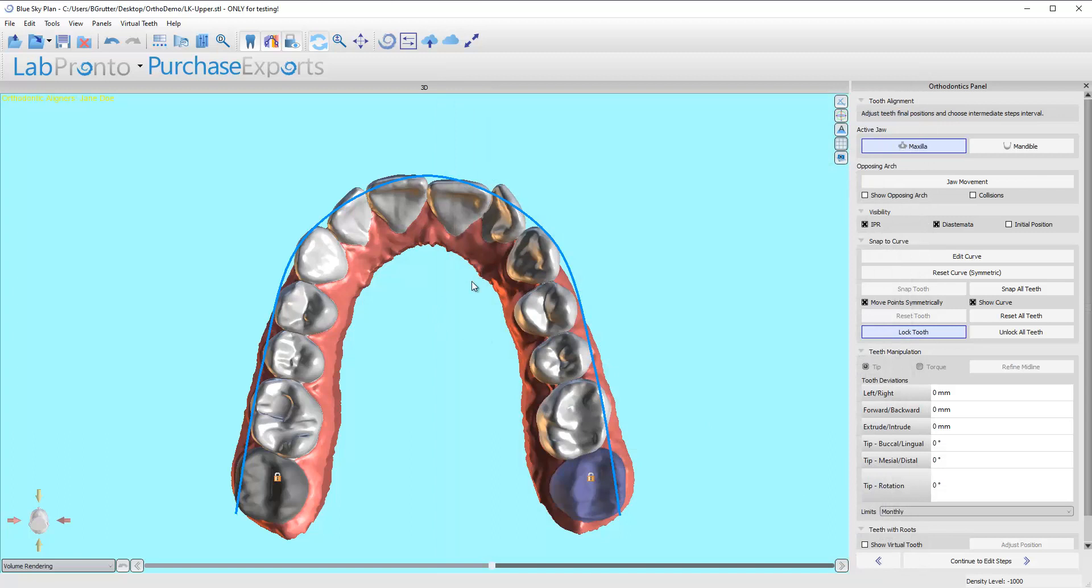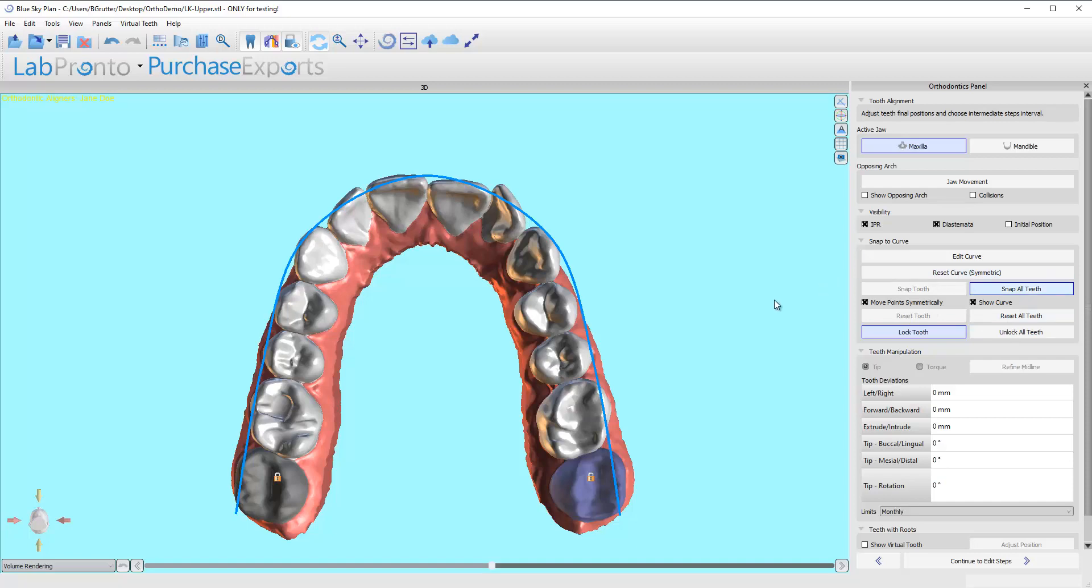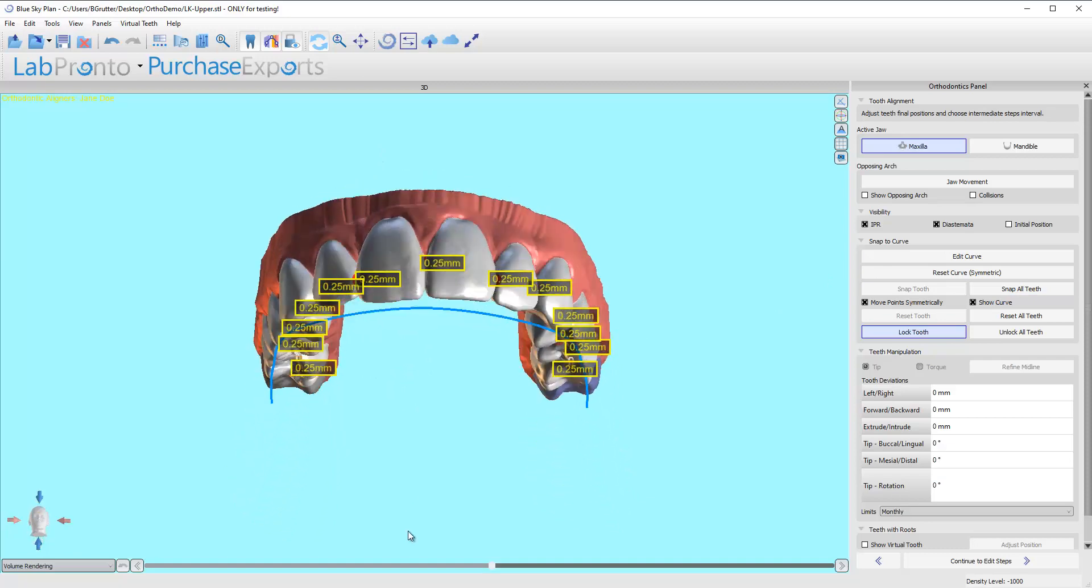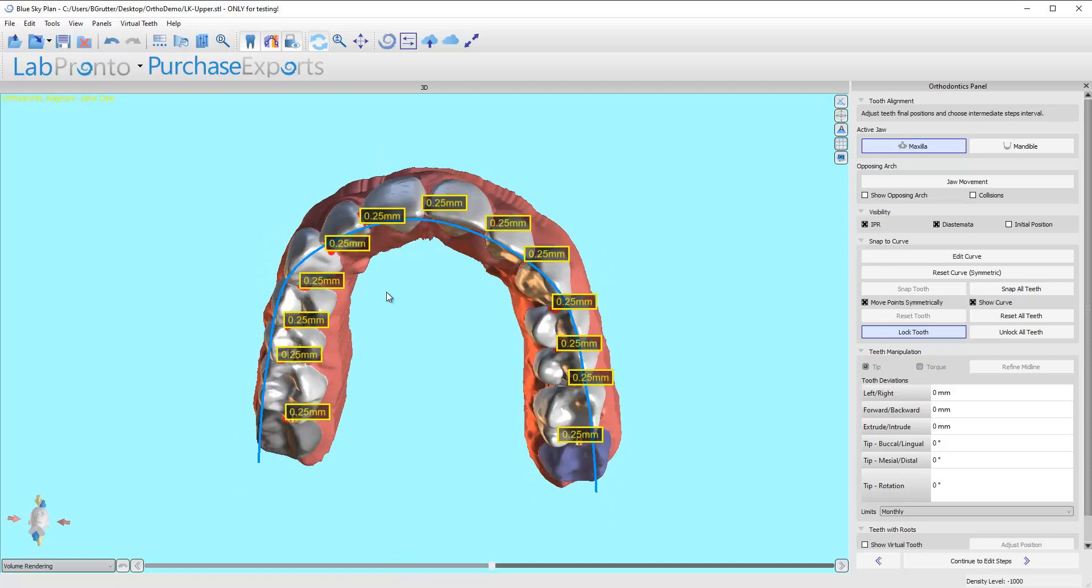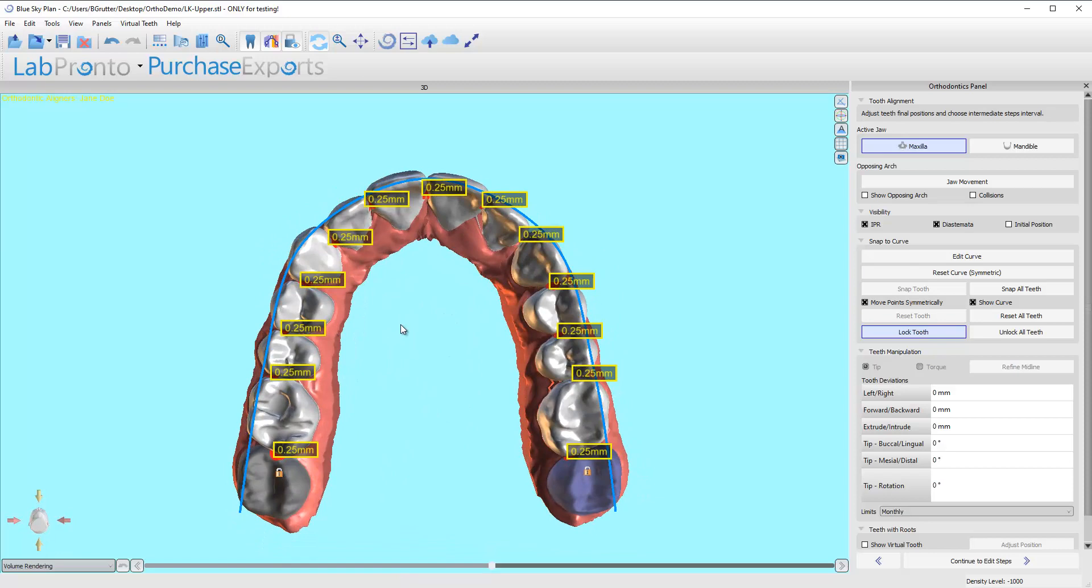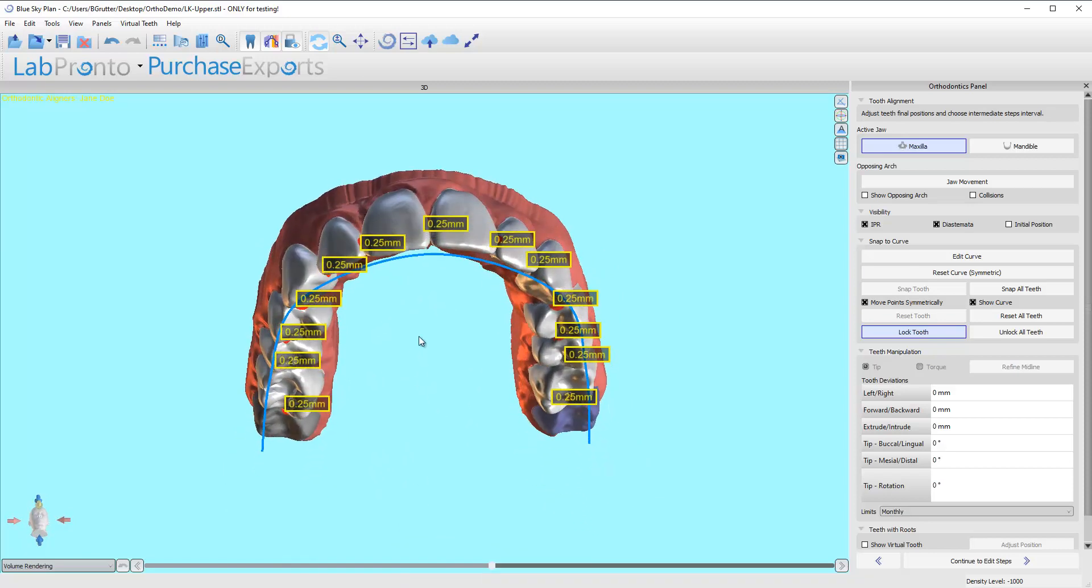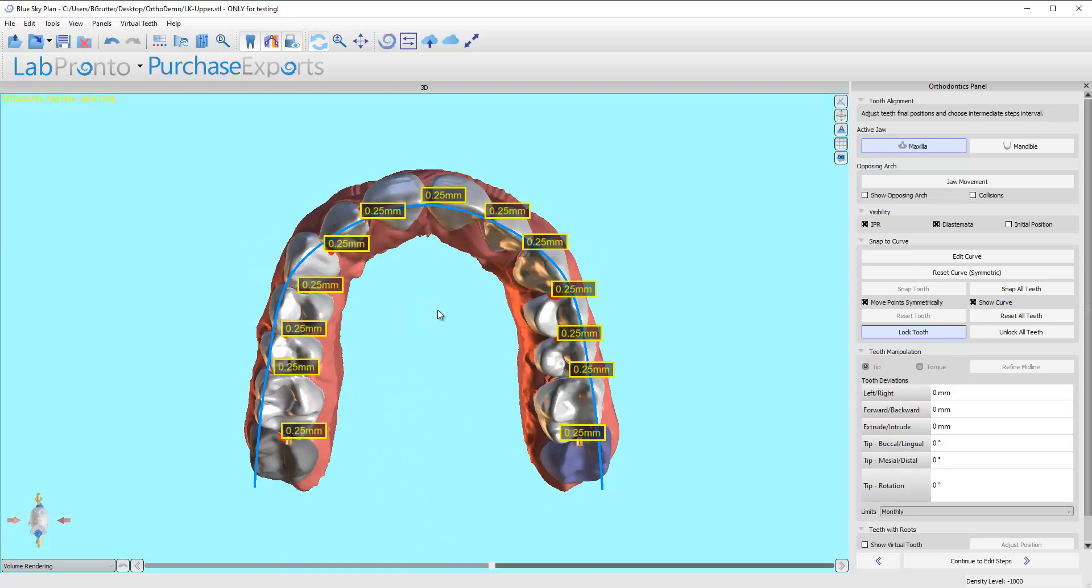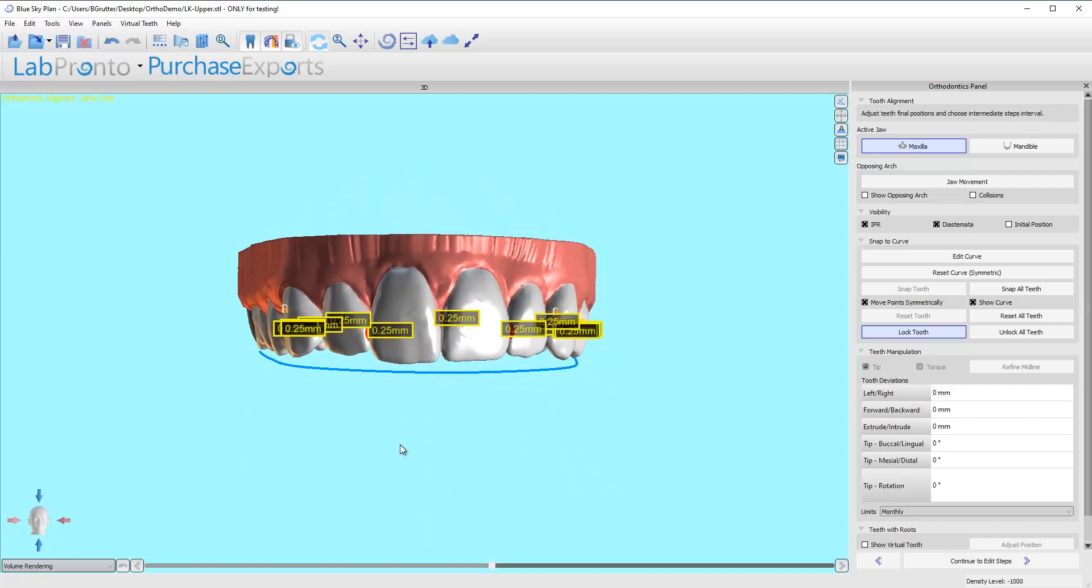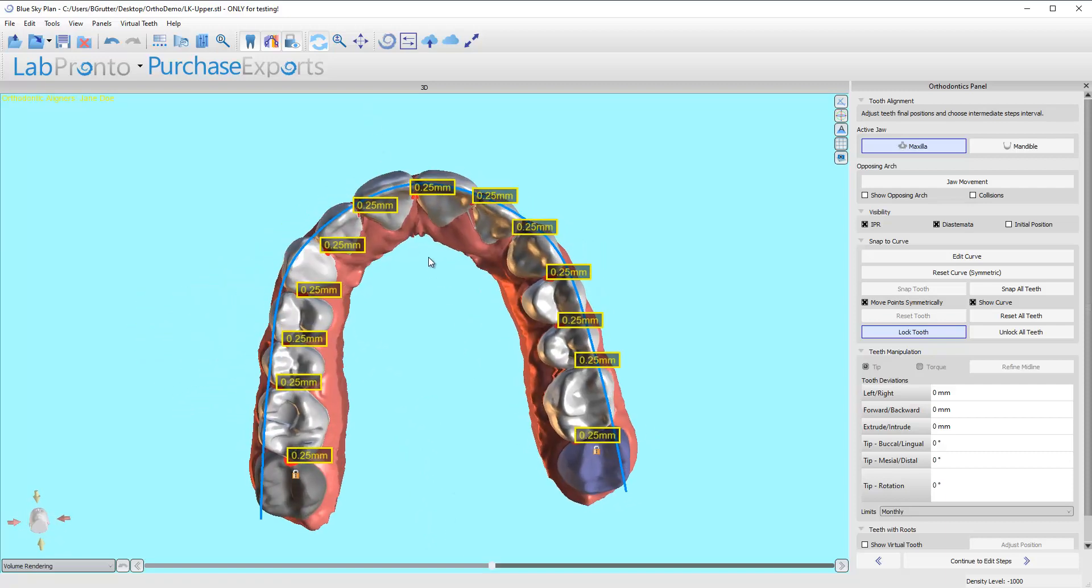Let's click okay and let's see what happens. This tooth is pretty blocked out here, so it's going to need some space. I honestly don't know what it's going to look like, so let's go ahead and click on snap all teeth right here. There it goes—it's aligned everything and it said okay, I'm going to need 0.25 millimeters of IPR pretty much everywhere to accomplish this. If you're okay with that, great, that's our setup.